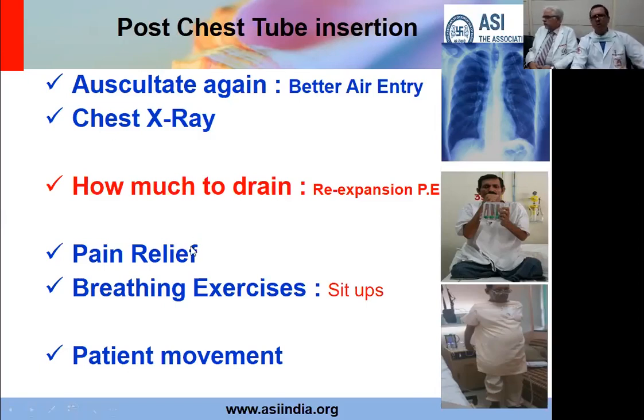Many times we feel, oh, it's a small procedure, I have given one tablet of paracetamol, that should be enough. Please be liberal with painkillers. It's important to give liberal doses of oral or parenteral painkiller. Have the patient pain-free and make him do breathing exercises, because your aim is to have your lung expanded. And the lung will only expand if the patient takes a deep breath and does exercise.